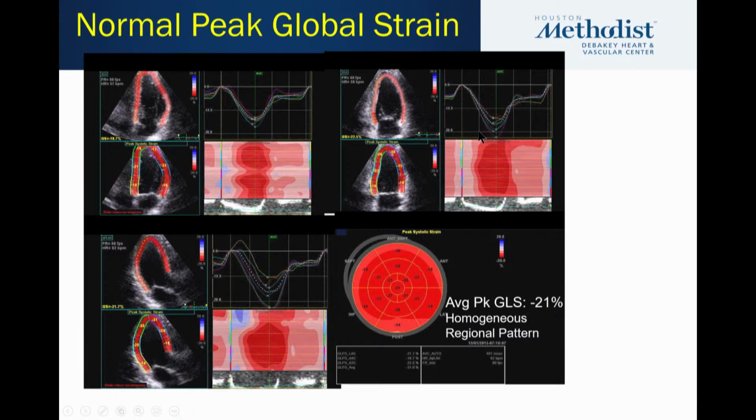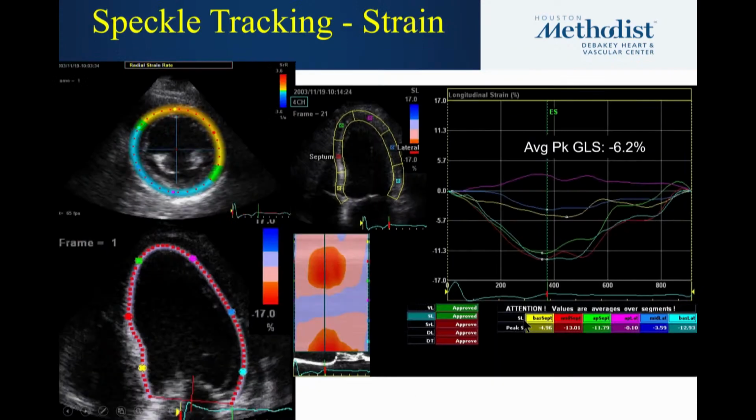However, from here on, I'm going to eliminate the sign because it can be confusing and just use 21%, because 14% is worse than 21%. And from a negative point of view, it's a higher value, but from a clinical point of view, it's a worse value. So let's get rid of the sign and let's just use the number.